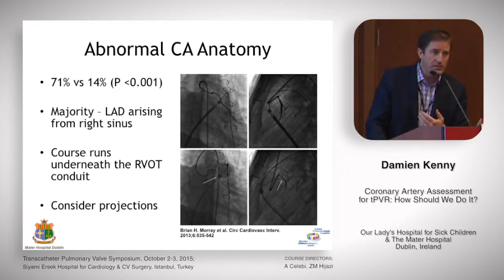I think the other thing, as we've seen this morning, is to consider your projections. Sometimes the projection with this caudal LAO view will allow you to look down the barrel and really give you a good impression of if there is compression and where that may be.